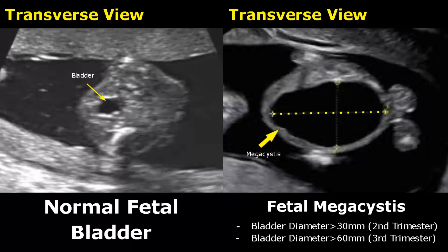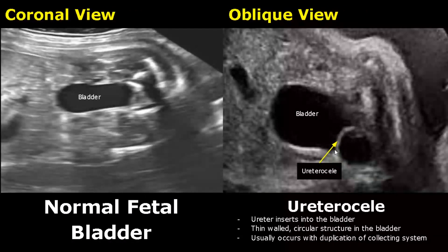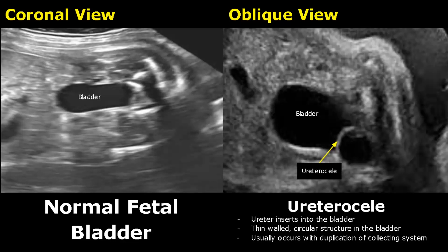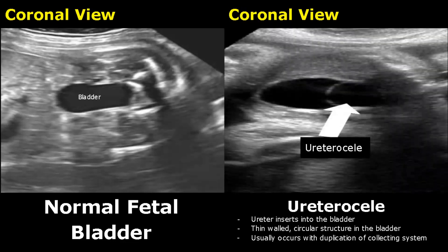A ureterocele occurs when the ureter inserts into the bladder. It appears as a thin-walled circular structure and usually occurs in the setting of duplication of collecting systems. The size of the circular structure can vary. Here we have another image of a ureterocele — you can see a circular structure inside the bladder.